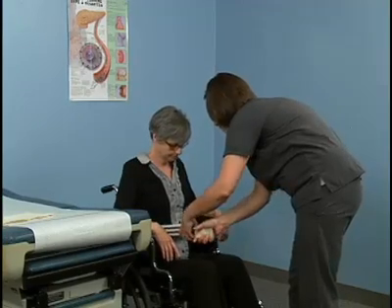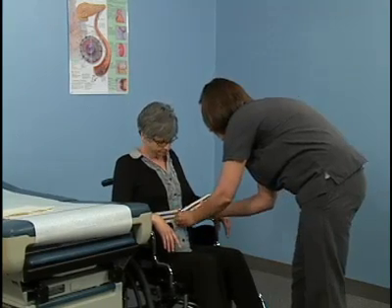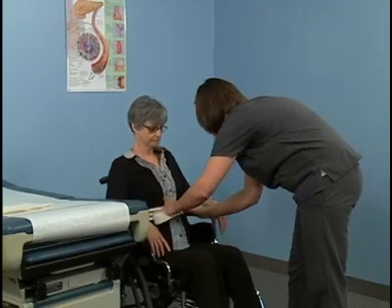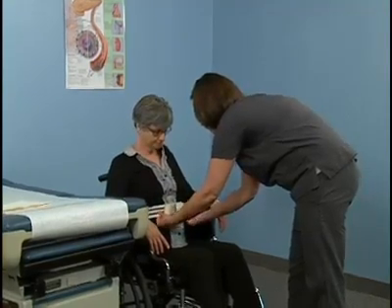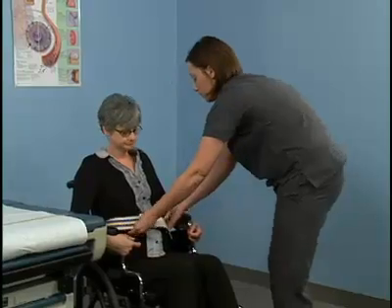Wrap the transfer belt snugly around the waist over the patient's clothing. The clothing protects the skin from abrasions. Fasten the buckle in front by threading it through the teeth and the two openings to lock it. There should be just enough space for you to comfortably insert your fingers between the belt and the waist. If it is too loose, the belt may slide up the patient.